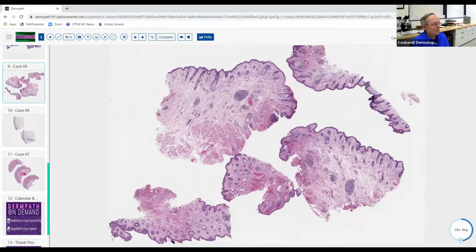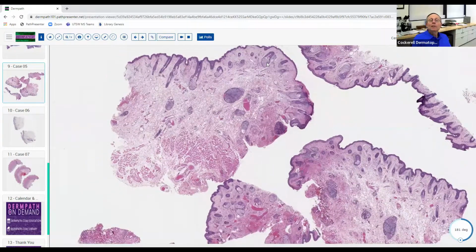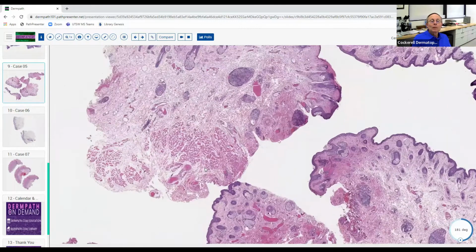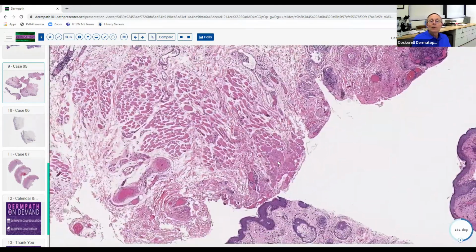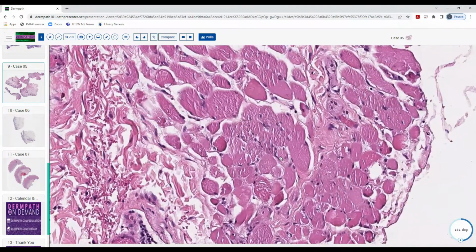So no problem. So I'm seeing a, I guess this is probably either punch or excisional biopsy. My guess is from the face, just because of the sebaceous and hair glands. Yeah, there's sebaceous lobules here. It's near the facial area. You're right. There's a little bit of, what's this down here, however? Yeah, like muscles. So it might be like the eyelid.